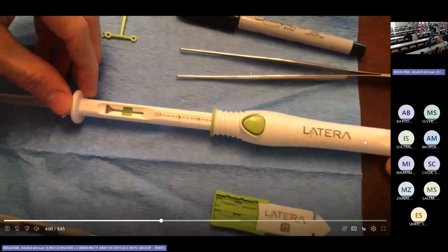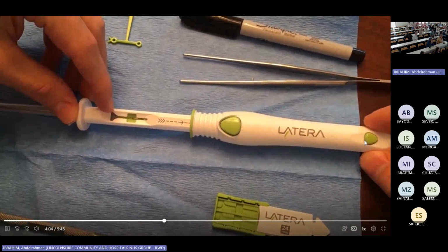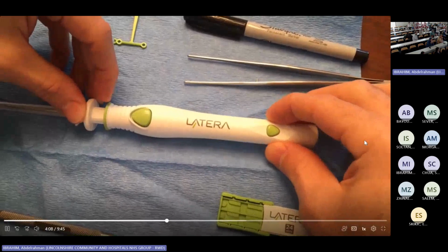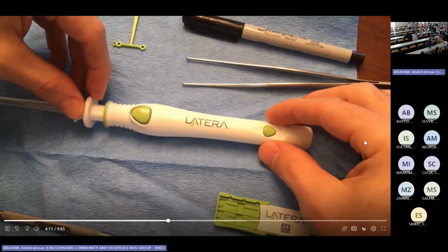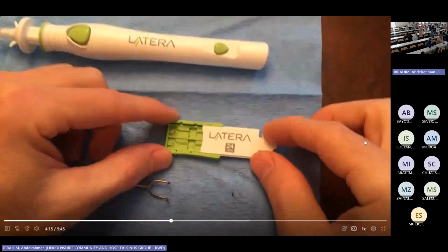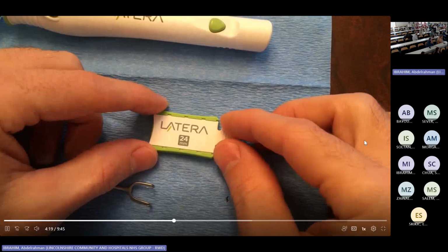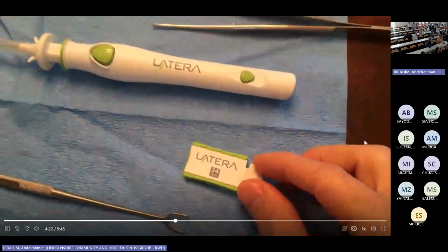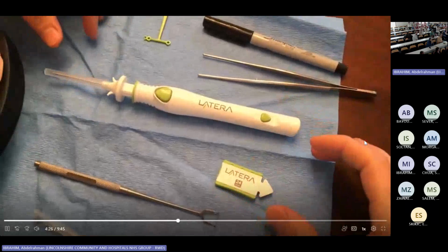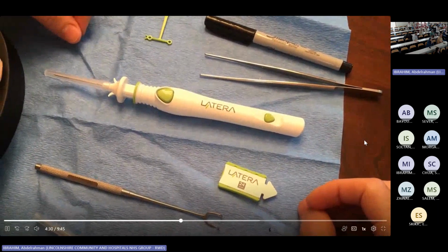And then advance the outer handle forward as I watch the implant advance into the cannula until I hear an audible click, and then I know the device is ready. I'll also close my implant tray lid to protect that second implant for the other side. So at this point, I'm ready. Notice when I load it, I kept everything on the Mayo stand instead of picking it up to avoid dropping the implant.